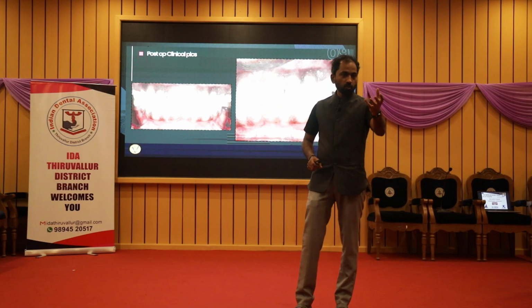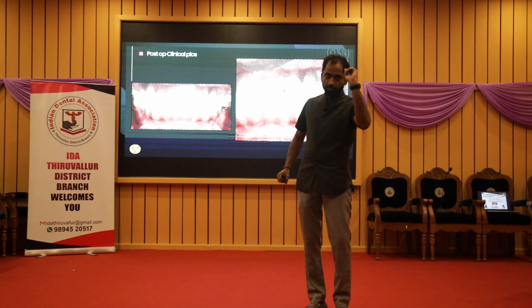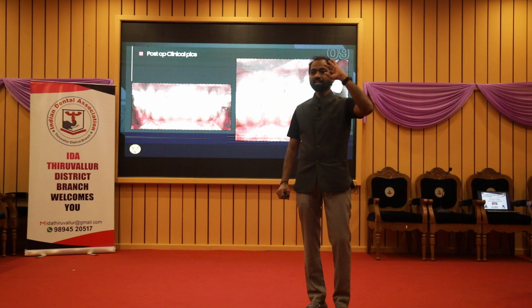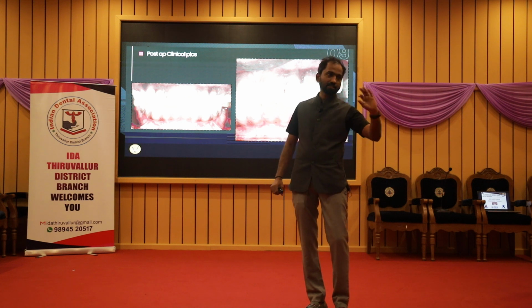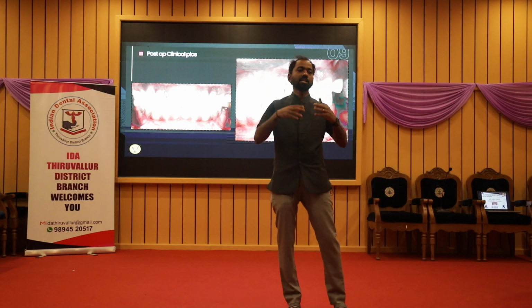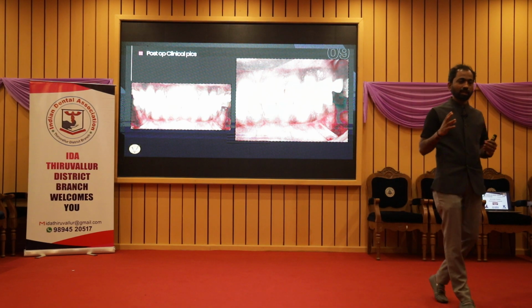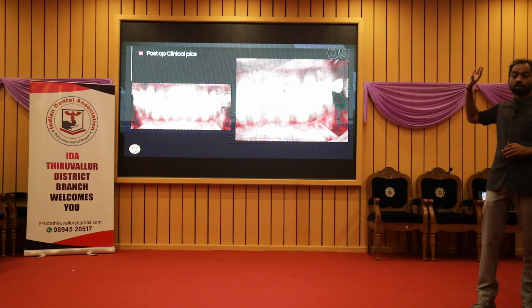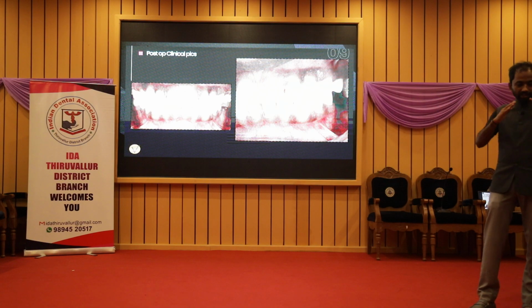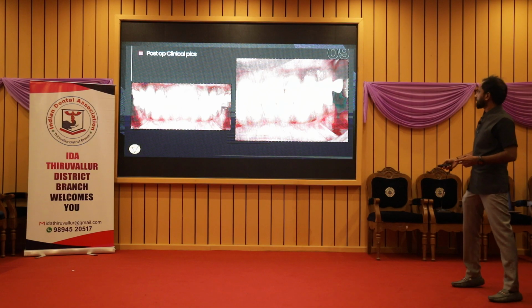But the problem is when you land up seeing the patient, you might not have the healing screw of the size you want, maybe a small one. Then you will end up putting that small screw. So you will get an emergence problem. Then you'll be forced to do it because you're busy. In a busy practice, you don't want to call the patient again. Especially in the aesthetic zone, you cannot compromise on that. If you want a wider cervical region, you will have to keep a wider healing screw. So that is something to keep in mind.